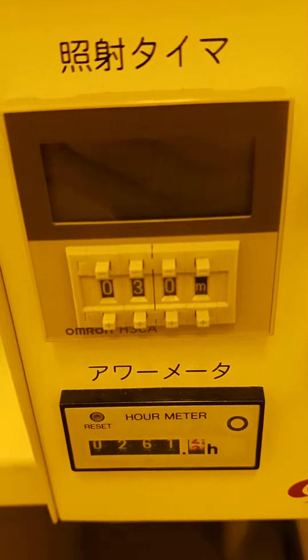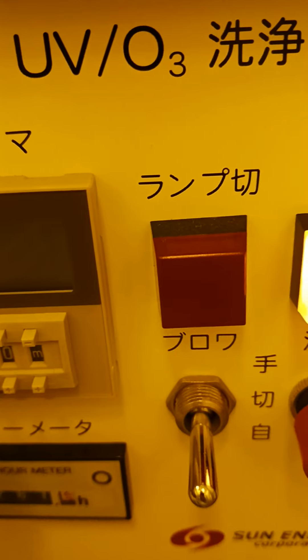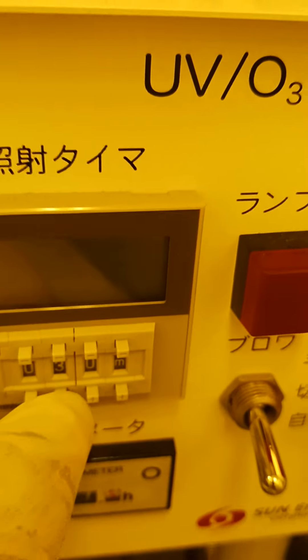And this is a timer. You can see the time is 30 minutes. You can change it easily — this is the plus button. Let's put it here, so now it shows 40 minutes.